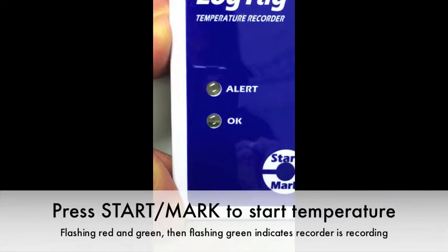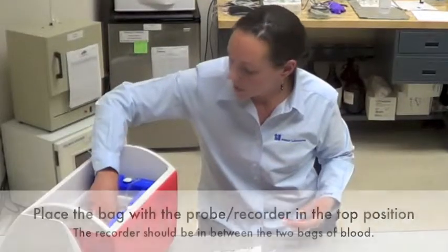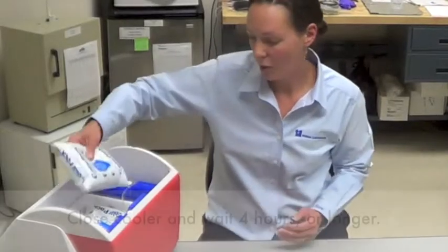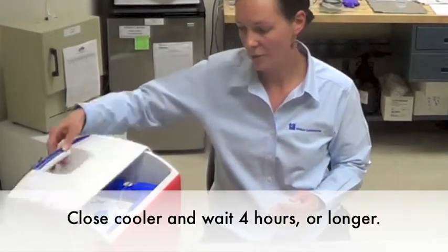Place the bag with the temperature recorder in between the two bags of blood, and then top it with your two remaining cold packs. Close the cooler.